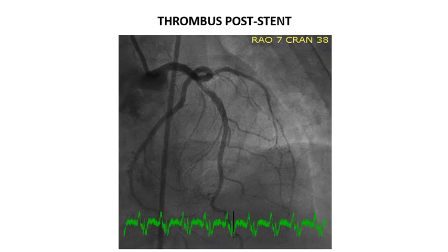This is still showing you an interpretation from a slightly different angle, showing you the presence of thrombus. This is the kind of pathology we look for, either narrowings, occlusions, or foreign bodies of some kind in the left coronary artery that can obstruct, or in any artery, in this case the left coronary artery, that can cause obstructions, lead to chest pain and a heart attack, and possibly death.